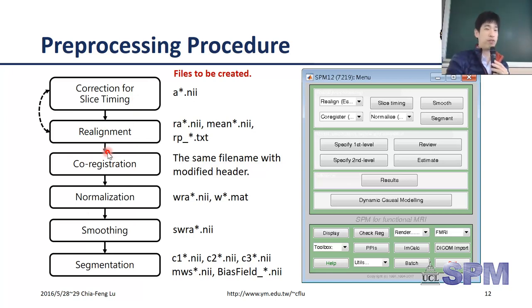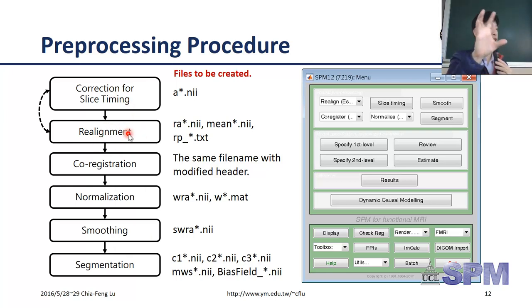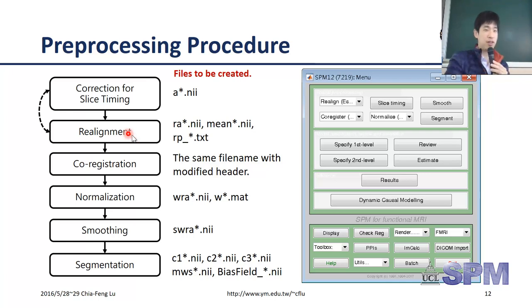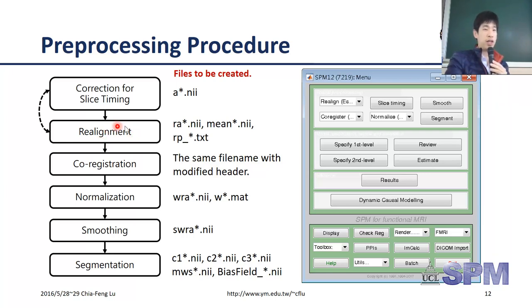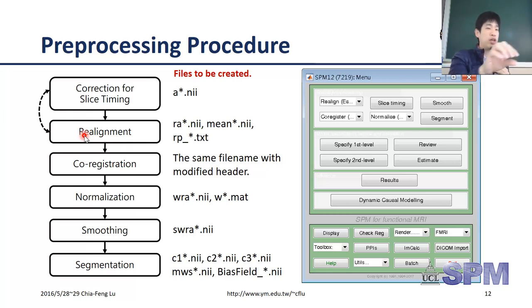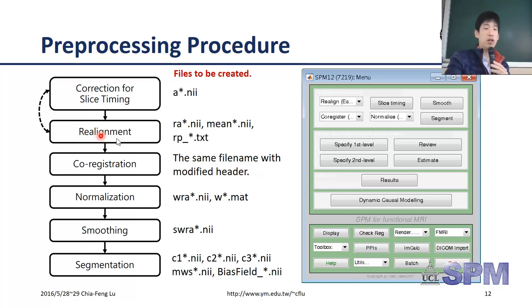The second step is realignment, because during imaging you cannot guarantee that the subject keeps their head still. We check whether the head has any motion during the whole scanning time. If there is significant motion, we realign all images - for example to the very first image or one acquired in the middle of the scan - to ensure images from different time points have the same spatial information.